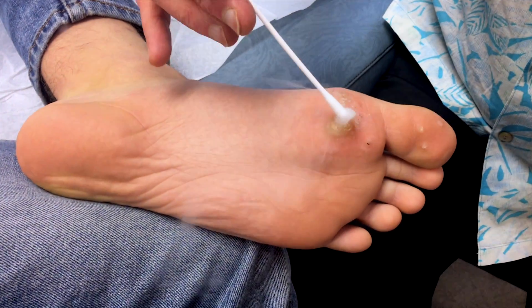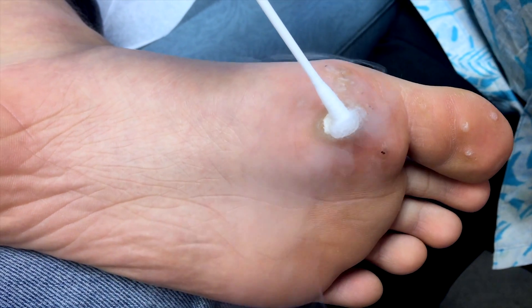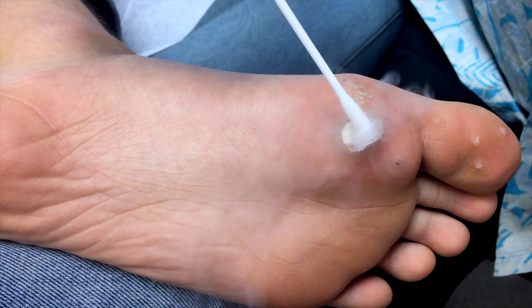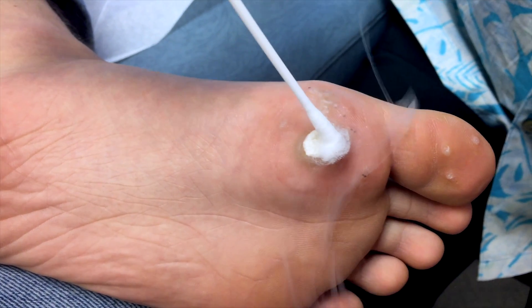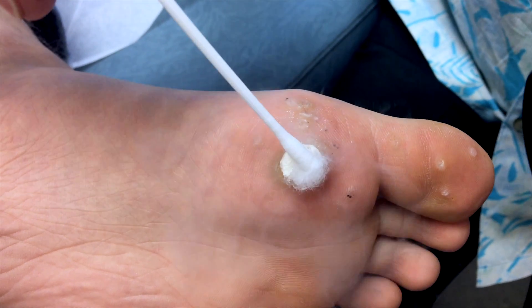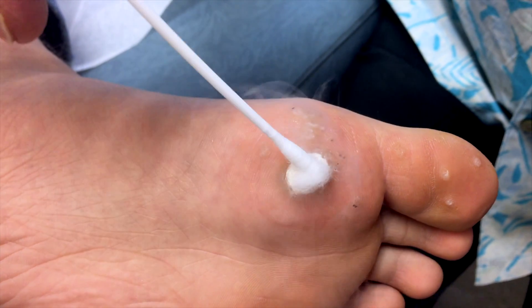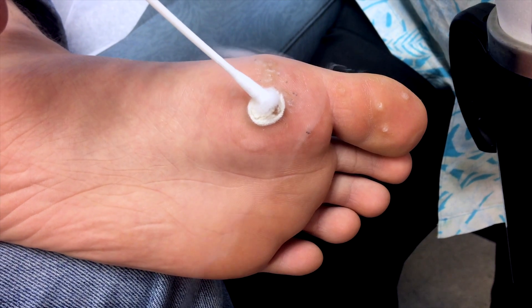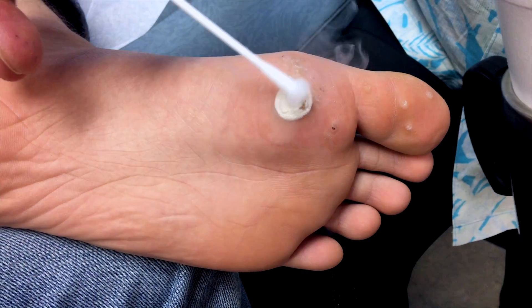Now when he starts yelping — so this won't hurt at first, it's really, really cold. See how it's turning white? That is liquid nitrogen. And the goal is to freeze. You've got a bit of a callus here where the warts in your skin have been reacting. We need to actually freeze deep enough to get through the wart itself and down to some normal tissue. So when you start to get normal tissue frozen, you start to feel it. You starting to feel it? Yeah, it's not that bad yet. That's when I know I'm not deep enough, if you know what I mean. But you're being very brave. Starting to feel that now? We're getting deep enough.